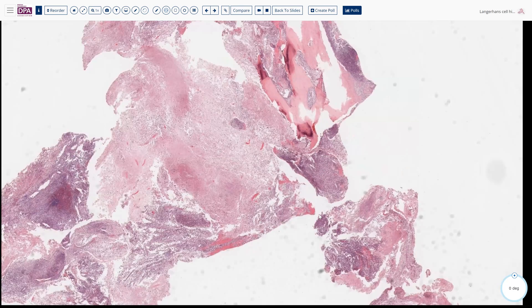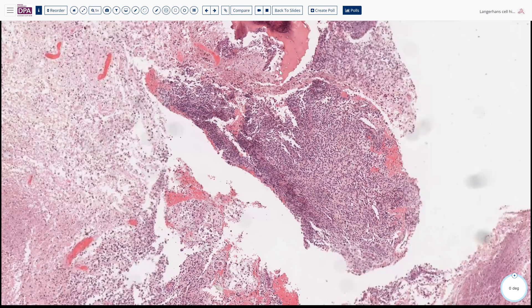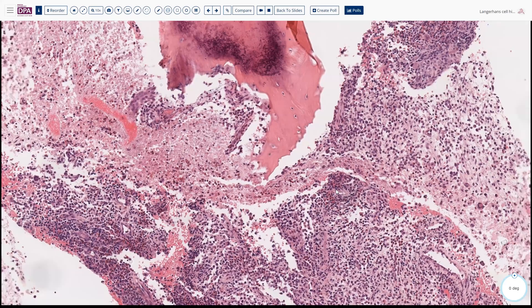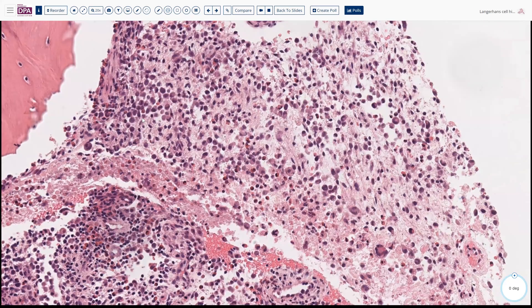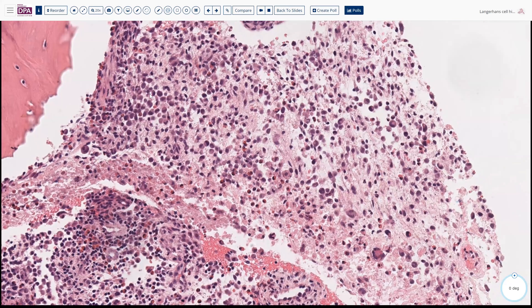At higher magnification, you can see how the lesion is destroying and eating away at the bone. There is an osteolytic giant cell type response with blood, cytofibrin, and a mixture of inflammatory cells. Looking at both the cells in this tissue and what's floating in the surrounding fluid, there are a fair number of mononuclear cells, occasionally binucleated cells with eosinophilic cytoplasm and ovoid nuclei.